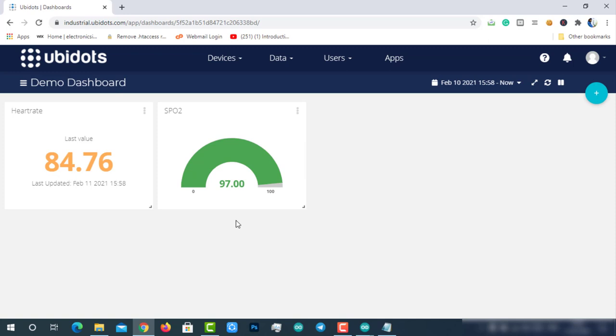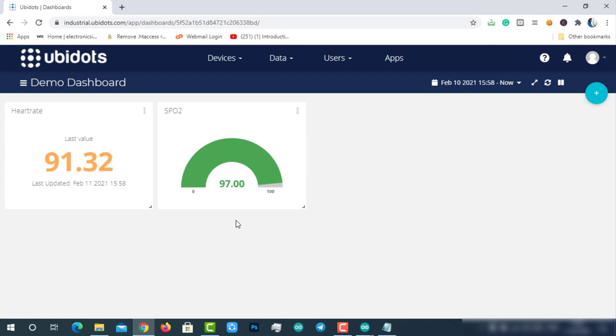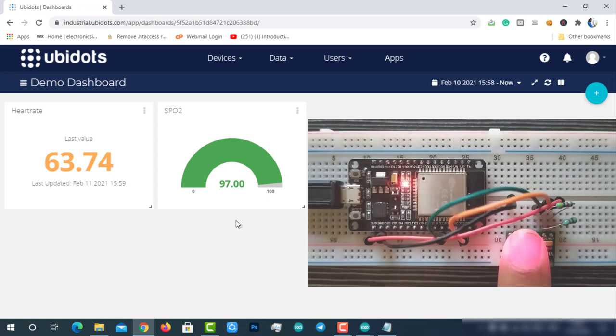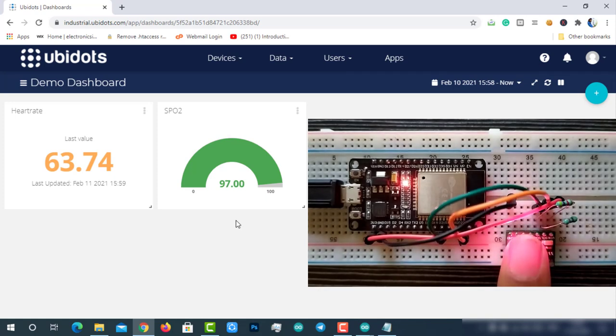Here, the data is being updated seamlessly. To make this SPO2 less than 95%, I'm going to remove the finger from the top of the sensor. So it will send zero reading which will satisfy the event condition. Let's wait for one minute to get the event alerts.